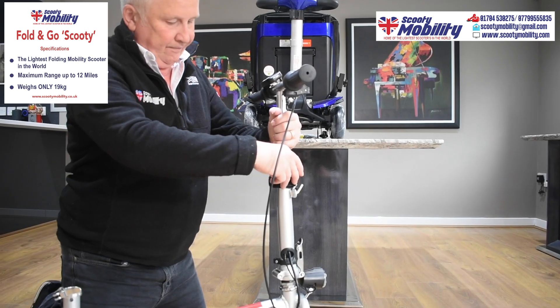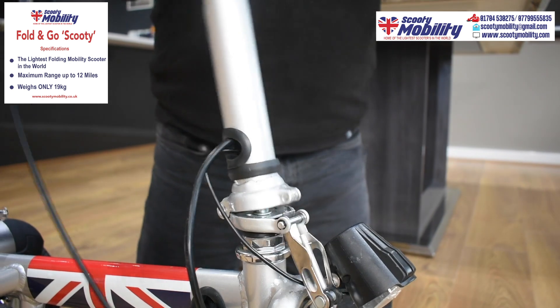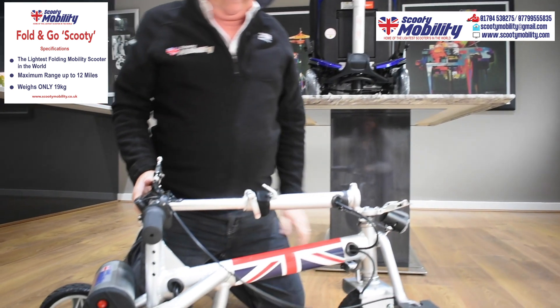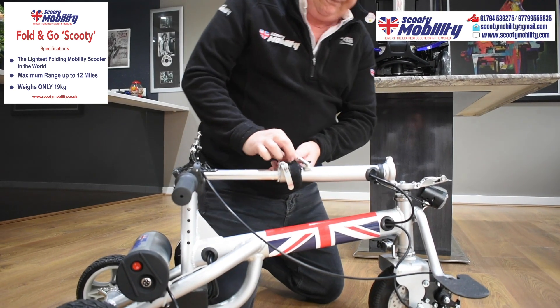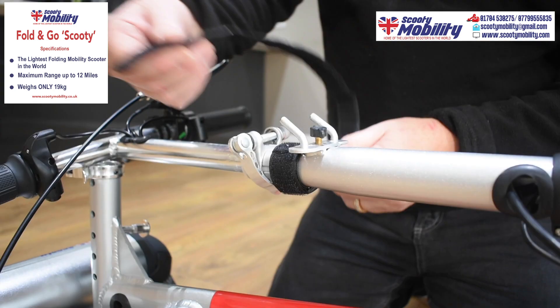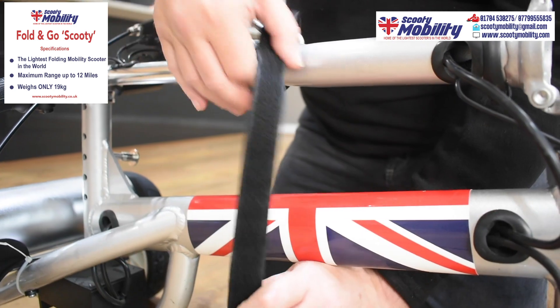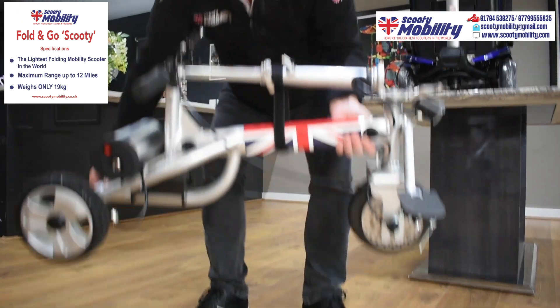Now I'm going to show you how you would lift the scooter. You drop the steering column, and there's a black velcro strap which goes around the steering column to stop it all flapping about and keep it nice and solid. It makes it much easier to lift. All we've removed from this is the baskets, and it's so lightweight — very, very lightweight. 13 kilos.